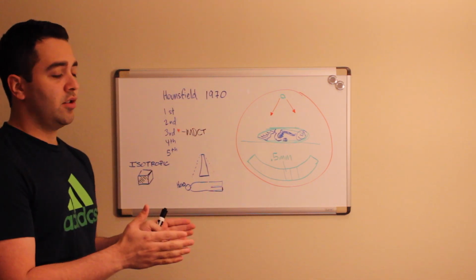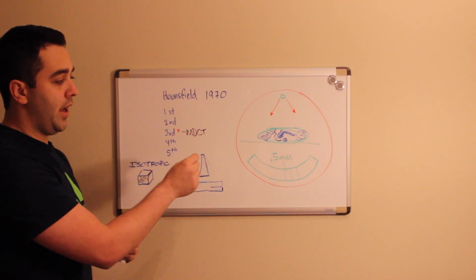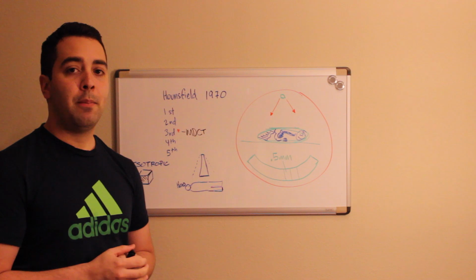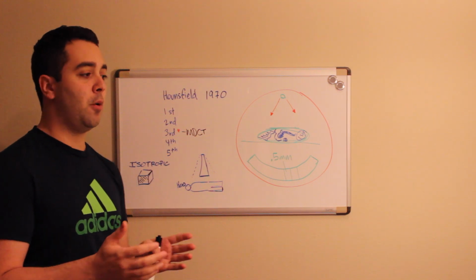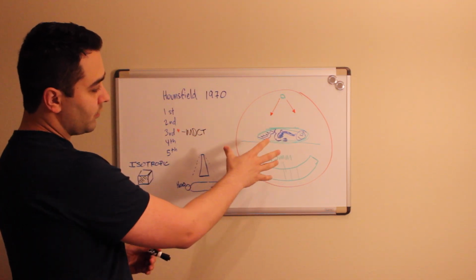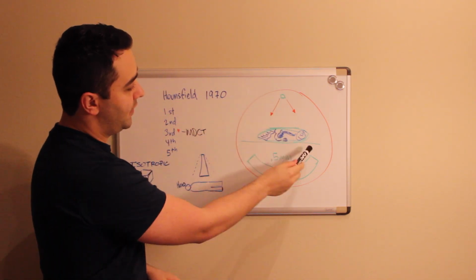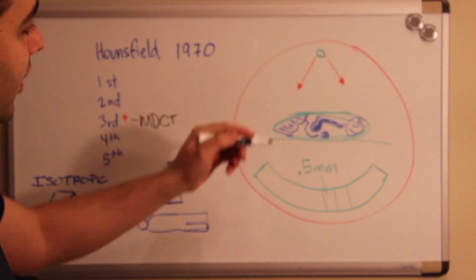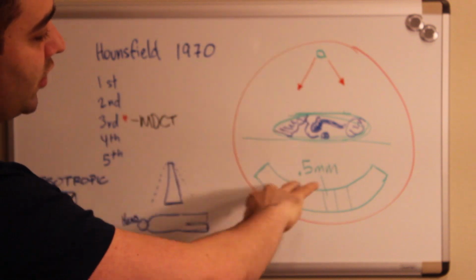However, although we reconstruct for display at 1 or 2 millimeters, if we really want to go thin, we can do a special reconstruction or display it as 0.5 millimeters per image slice. And we often do that for aortic angiographs, and for very specific measurements we go back and use a very thin cut. In this picture, what I'm showing you is kind of looking from below, and we're seeing an axial section. This is our generator. We have two fan beams. Here I just drew some structures, and our x-rays are going to go from here and hit the detectors here, and this whole structure rotates.